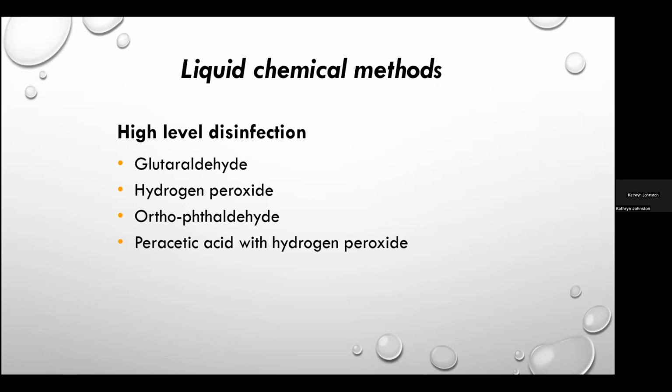As I stated, the liquid chemical method is the most frequently utilized method in hospital systems, and multiple germicidal agents exist in liquid form. The problem is that this liquid method requires very many controls during its execution. Since it's carried out for the most part manually, all stages of the protocol recommended by the manufacturer and validated have to be closely followed. So you really need a step-by-step standard operating procedure that is followed every single time.